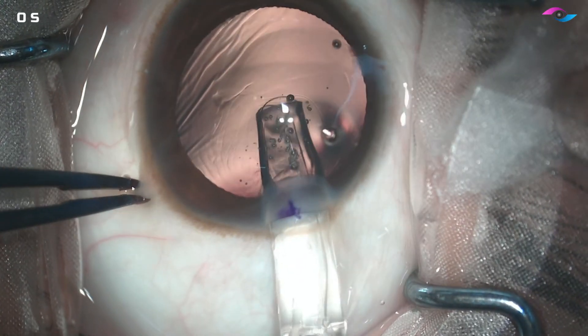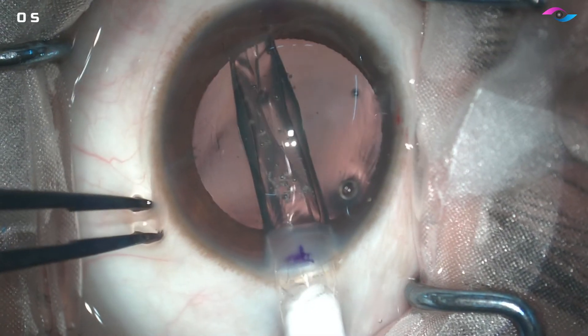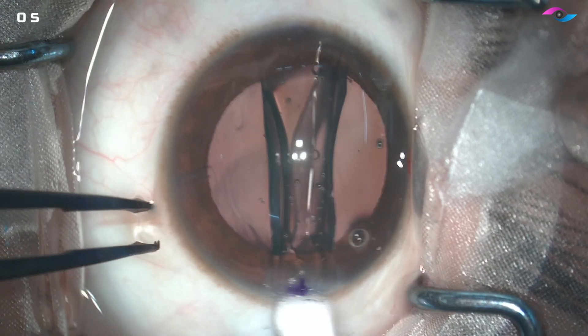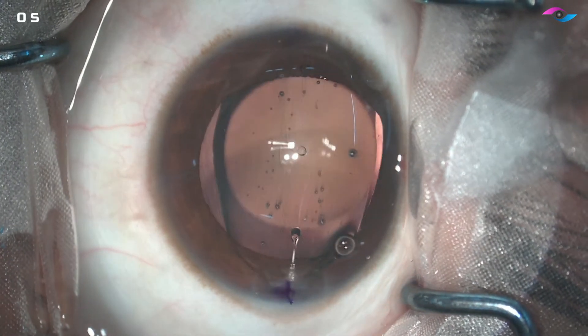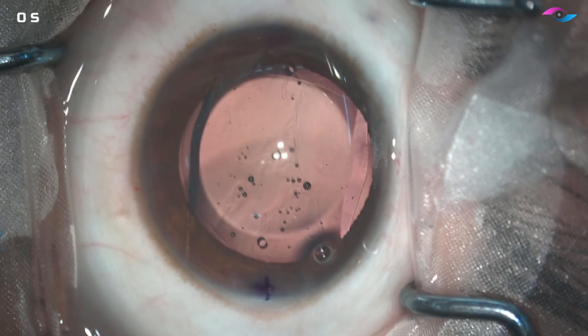This pre-loaded lens is being injected slowly and gradually. We have to make sure that the plate haptic has the holes and that is on the right side — that is the correct orientation to ensure a good vault. We also need to make sure that the lens is not flipped upside down.